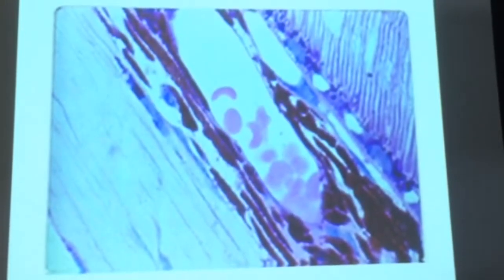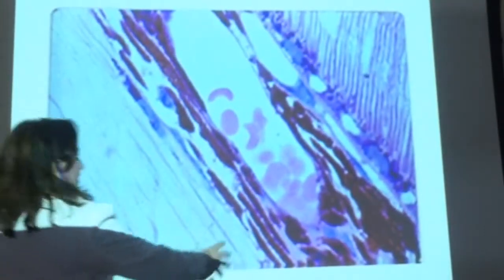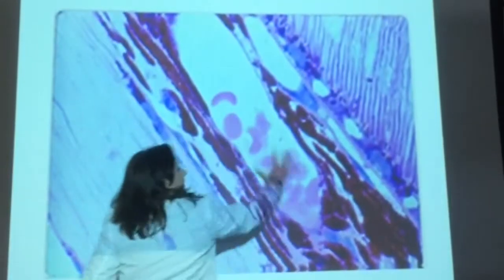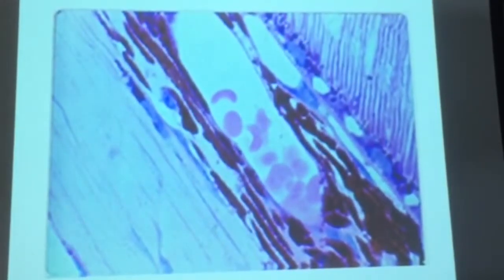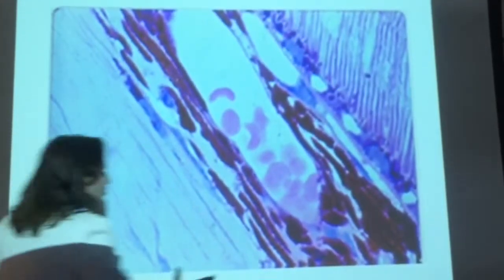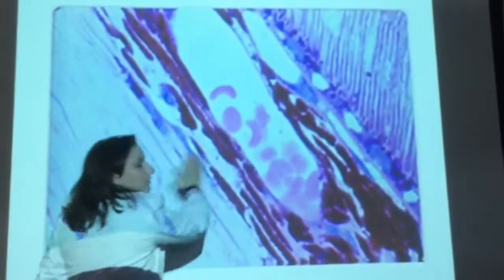And this is what you're doing, looking at the retina. This is a hard one. Make sure you take your time when you look at this. The first thing is notice red blood cells here. So this is the blood vessel. That's the first thing you should see, nice and easy. So when you think blood vessel, you think choroid. So this is your choroid layer, all of this right here.